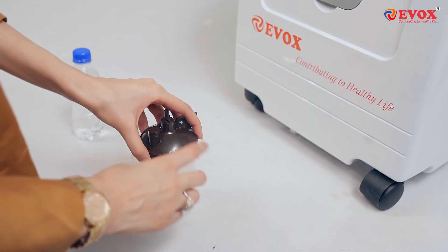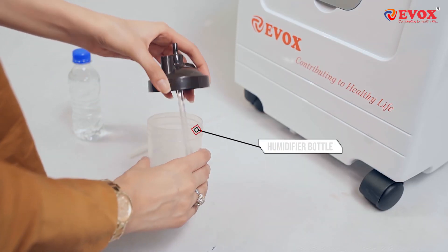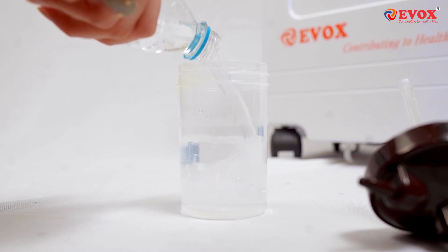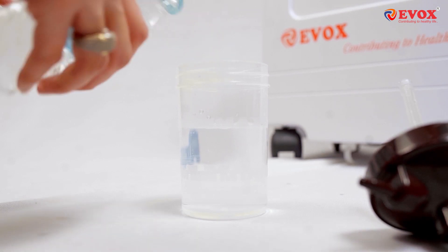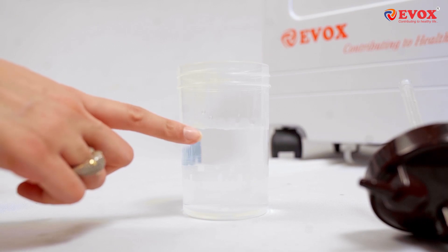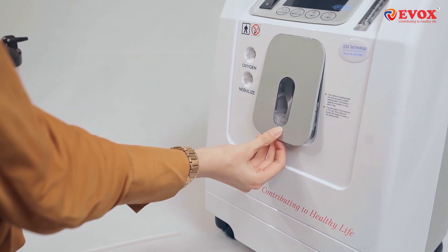Next up, we'll fill the humidifier bottle. Make sure water does not exceed the maximum marking, and then place it in position.